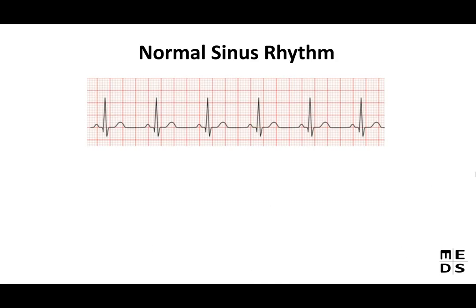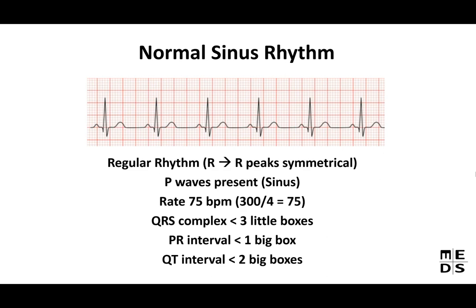First, here's what a normal sinus rhythm looks like. You'll have a regular rhythm — from R to R the peaks are even and symmetrical throughout. The P wave is present, and the rate is about 75 BPM (300 divided by 4 big boxes). The PR interval is less than one big box, QRS less than three small boxes, and the QT interval less than two big boxes.